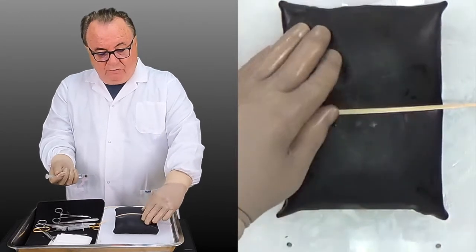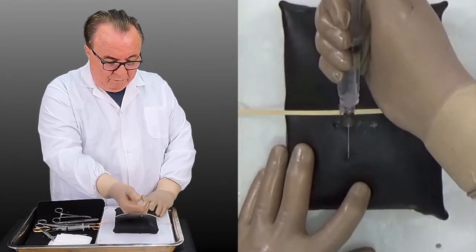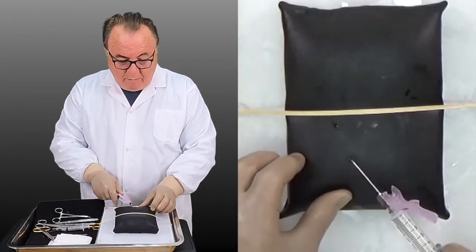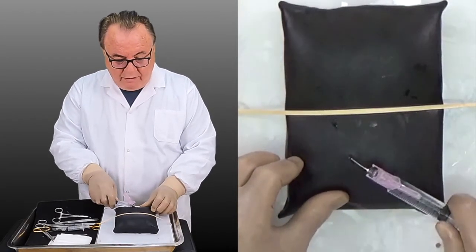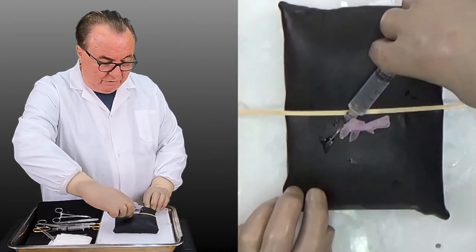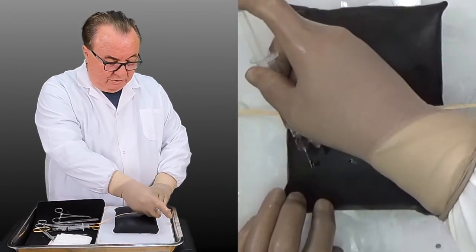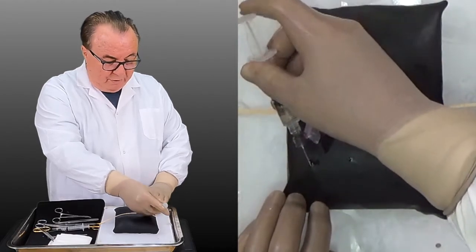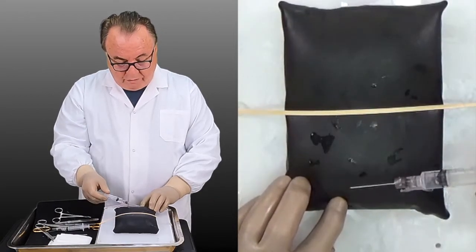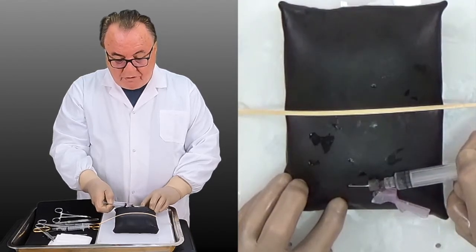Here are our four abscesses. Let's choose to drain this one. We'll do a local field block by going circumferentially around the abscess — not into the abscess but around it, so that all the skin is anesthetized. You can't leave even the smallest bridge of unanesthetized skin or the patient will feel it. Now you've made your field block.